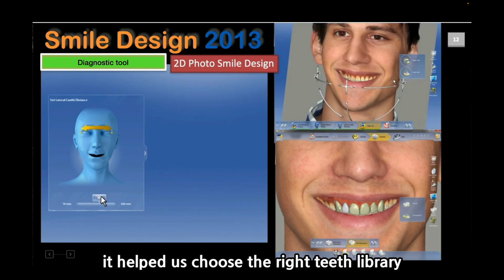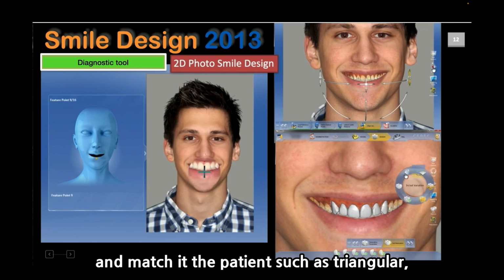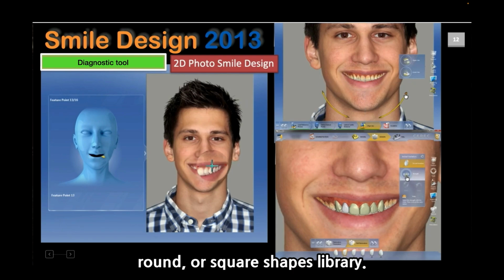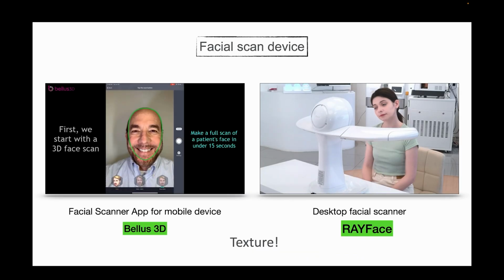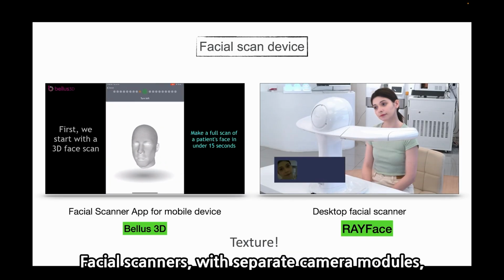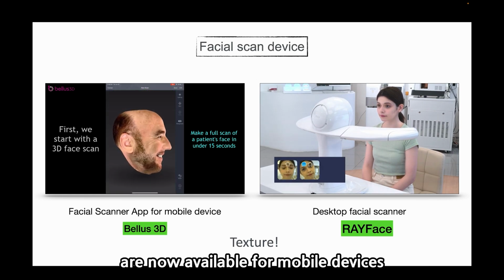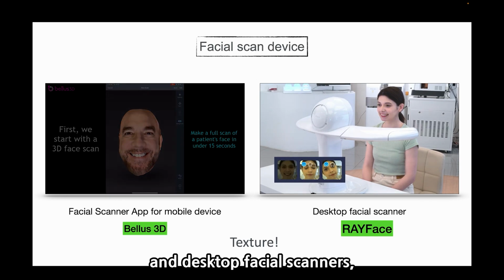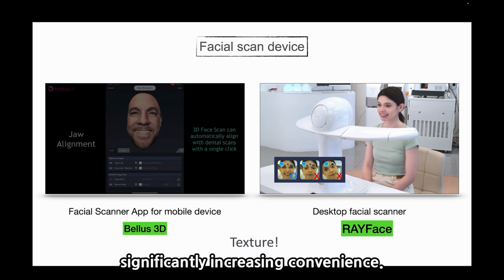It helped us choose the right teeth library and match the patient, such as triangular, round, or square shape libraries. Facial scanners with a separate camera module are now available for mobile devices and desktop facial scanners, significantly increasing convenience.